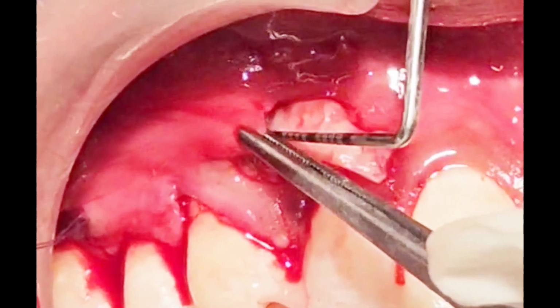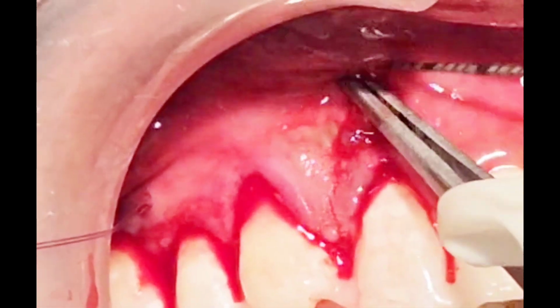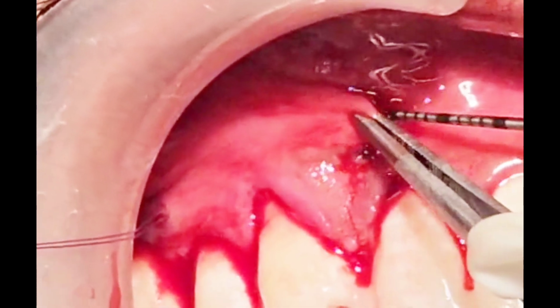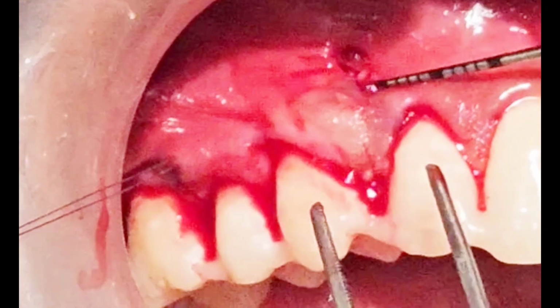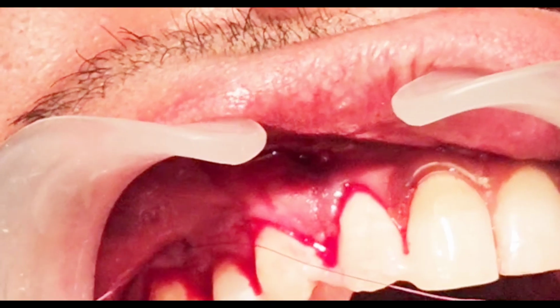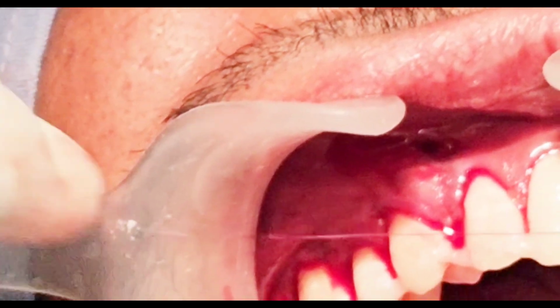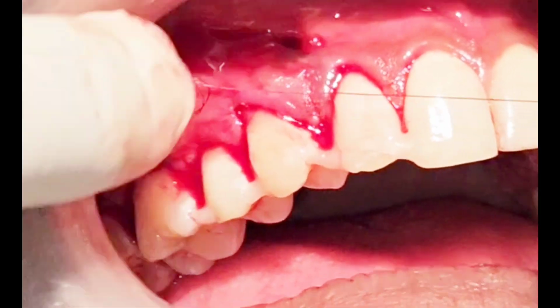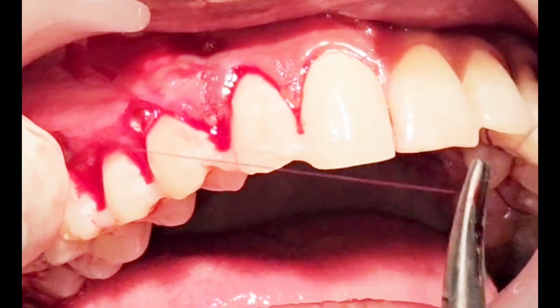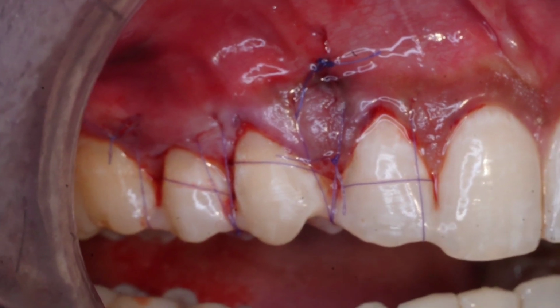and then after using the probe as well as the tissue forceps, we try to insert the connective tissue graft inside the pouch that is created in the tunnel. Once that is achieved, we can put a knot onto the distal aspect of the premolar. In a similar manner, the graft can also be secured on the mesial side to have extra stability for the connective tissue graft. After stabilization of the connective tissue graft, we need to suture the flap.